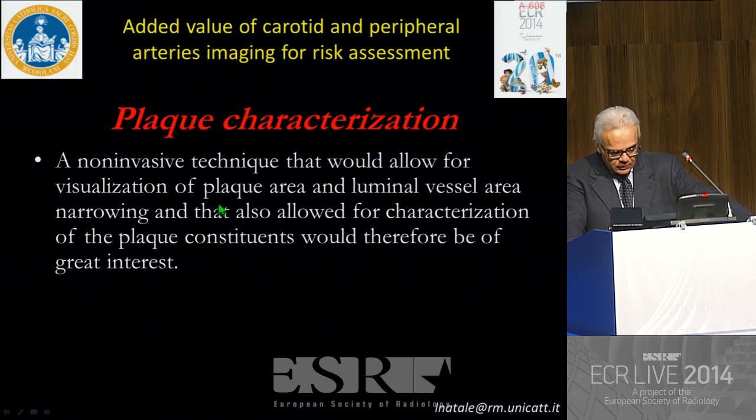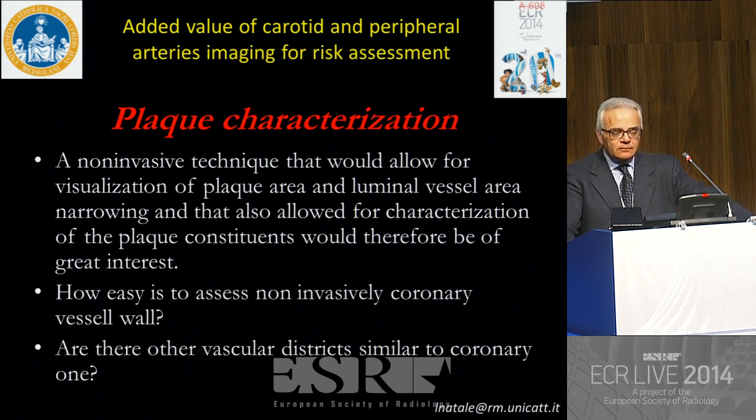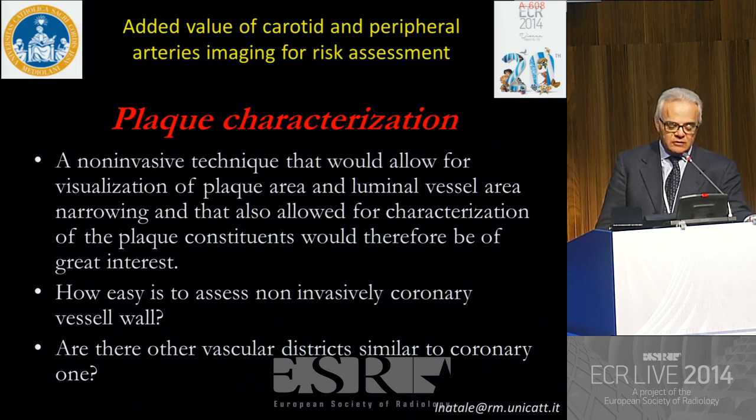words that I said before, it's important that a non-invasive technique can be used to visualize not only the lumen, but mostly the plaque and the characterization of the composition of the plaque. And there are some questions arising, of course, from this. It has been partially shown in the previous presentation.